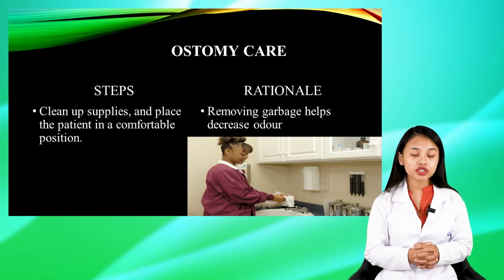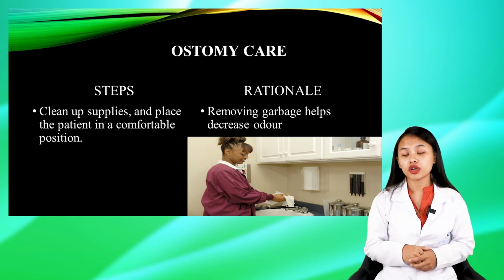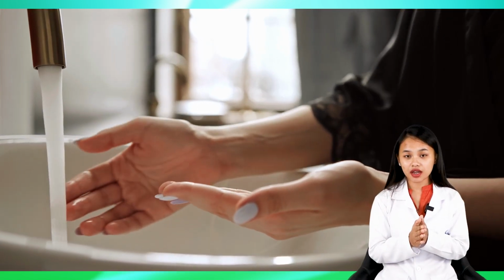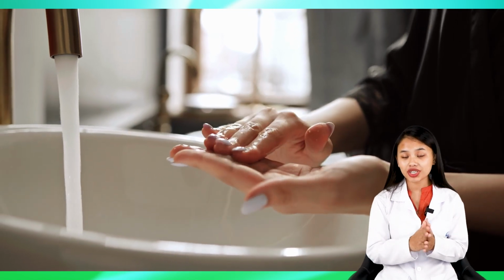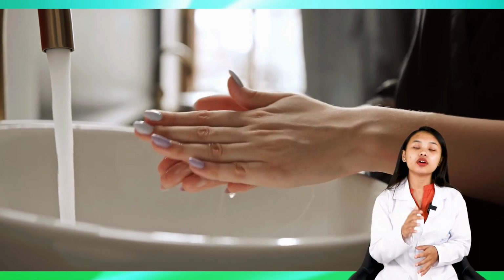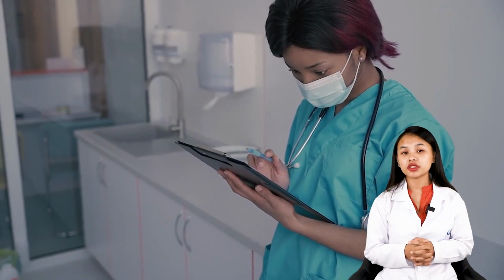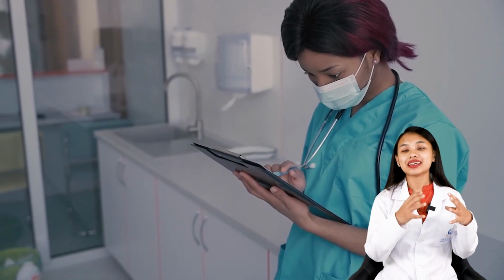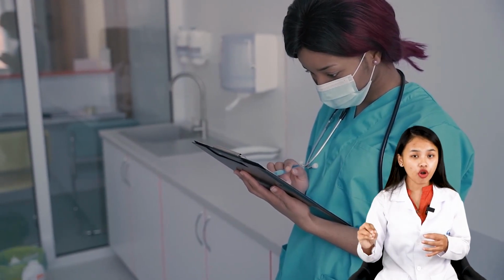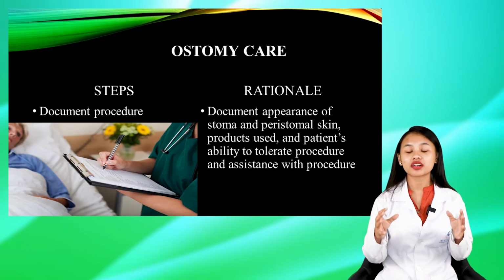Why do we do this? It is very important to do this in order to prevent cross-contamination. And once this is done, we can perform hand hygiene and we must document the procedure. Here, while documenting the procedure, it is very important that we mention the time, the date, as well as the procedure which was performed, what was the client response, as well as their concern.